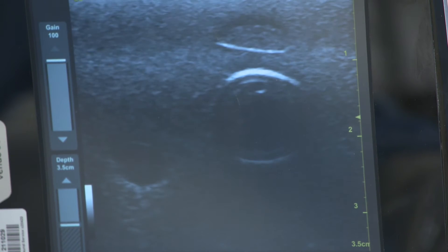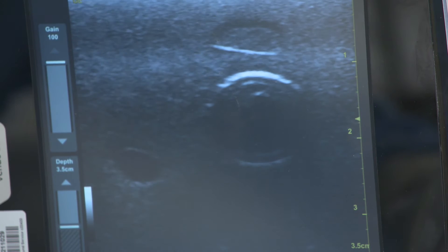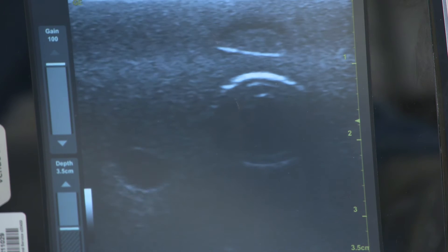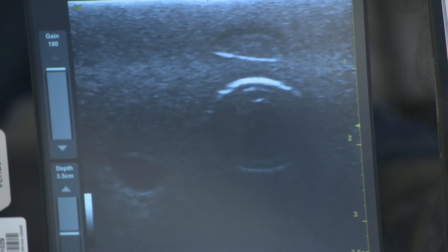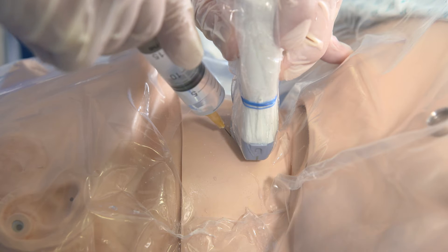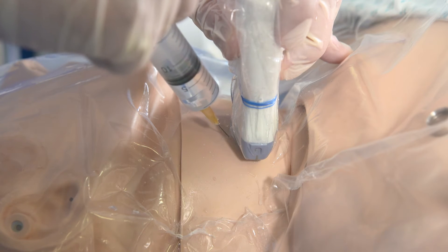And on the left, the pulsating common carotid artery. In real patients, there can be some variation to what you see, and sometimes the common carotid can be underneath the internal jugular or to the other side of it. Following this, use the ultrasound to guide the needle down to just on top of the internal jugular and inject lidocaine through the tissues.